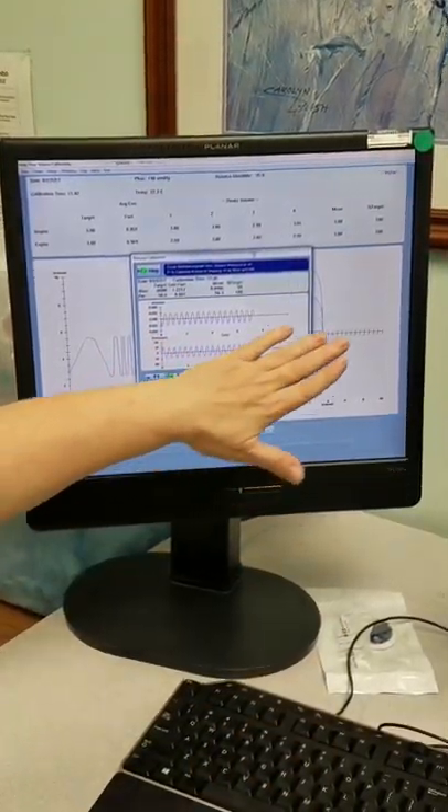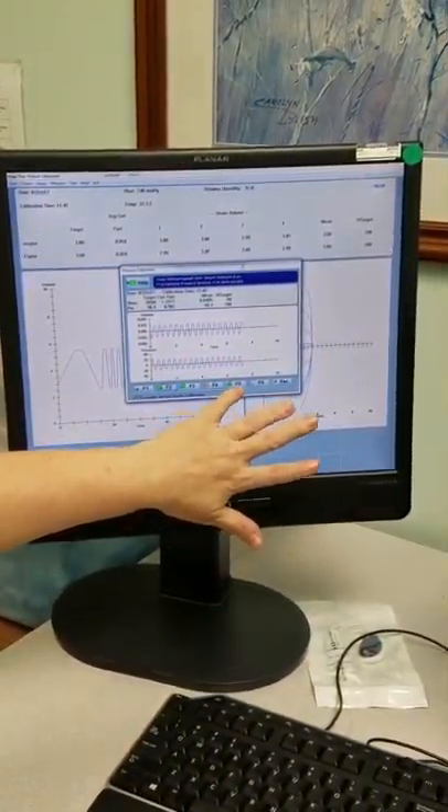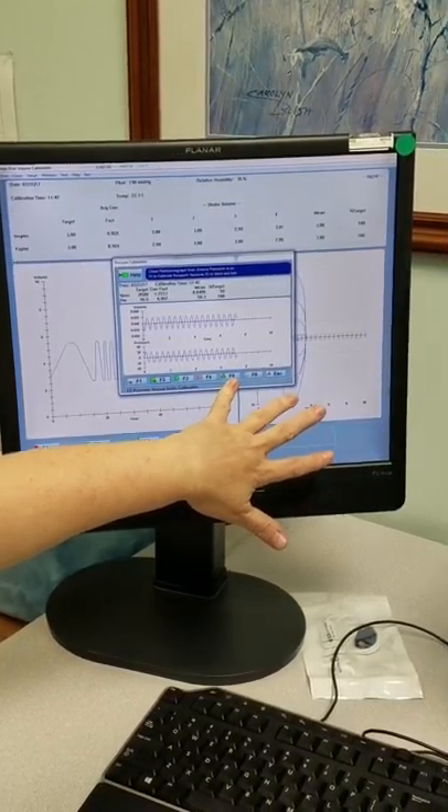Alright, now it came up — it's done. You hit F5 to print the report for that procedure.